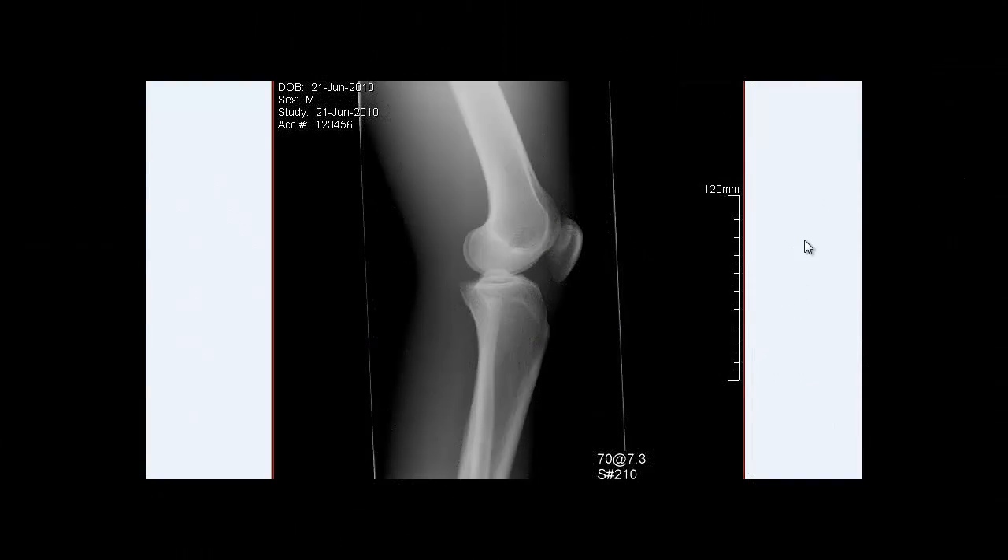Welcome back. This is going to be a quick tutorial on how to tell if our lateral knees are rotated properly, which way they are rotated, whether there is a tube angle, and if so, if there's too much or too little. These are all things we need to evaluate if we are going to be repeating a lateral knee, which happens a lot in the hospital.